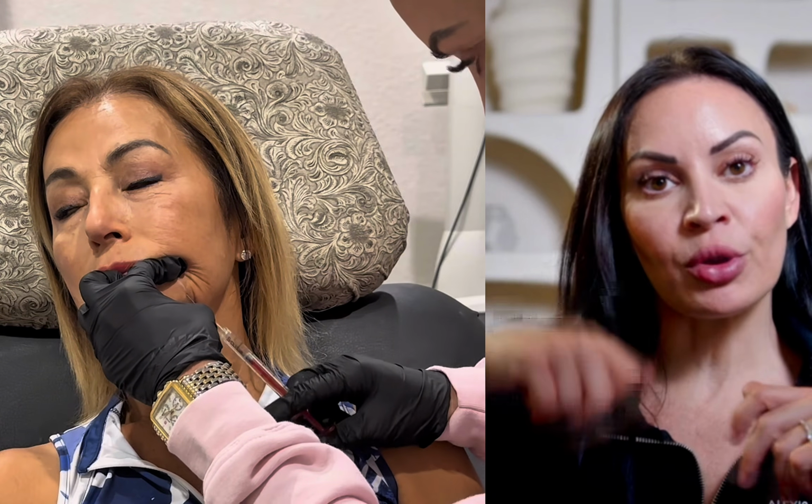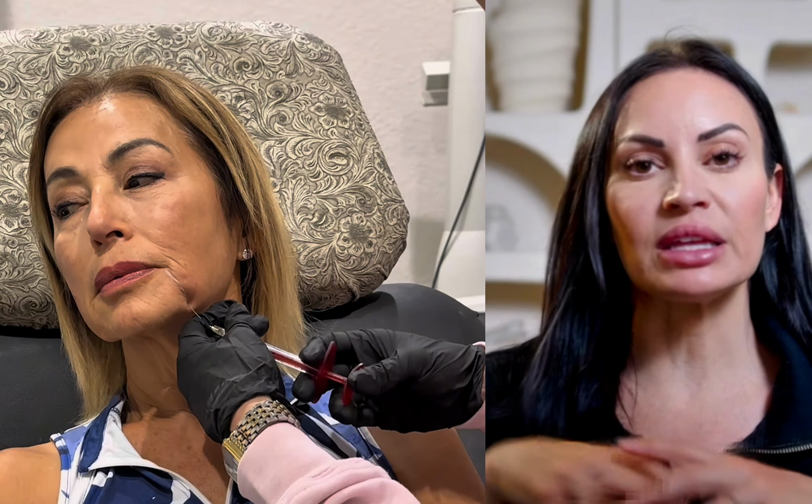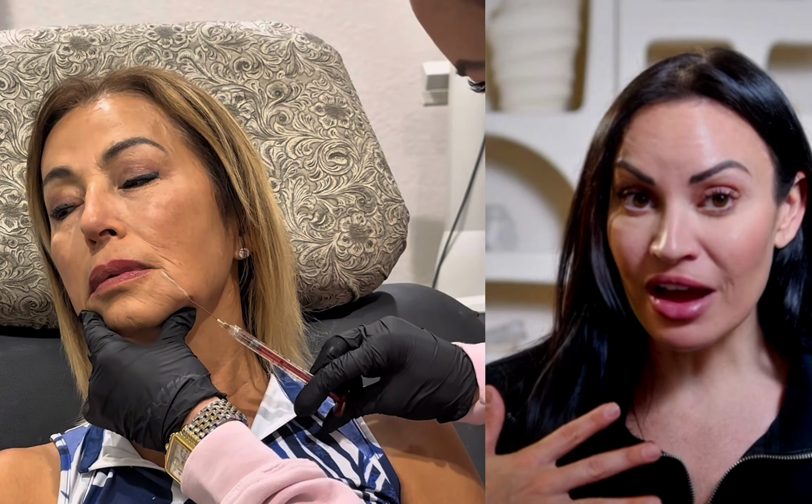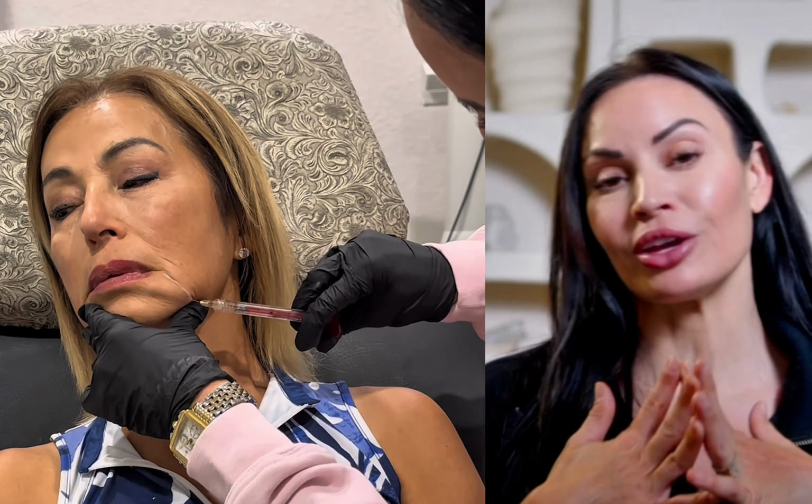So I perform retrograde threads, just going back and forth. You will never see me lay one big thread of product. I'm going back up, laying a nice thread, moving the direction of my cannula, laying a nice thread, and I'm just painting the area and subcising at the same time. I think it's incredibly, incredibly important to just take your time. But a 25 by 1.5 inch cannula is my go-to.